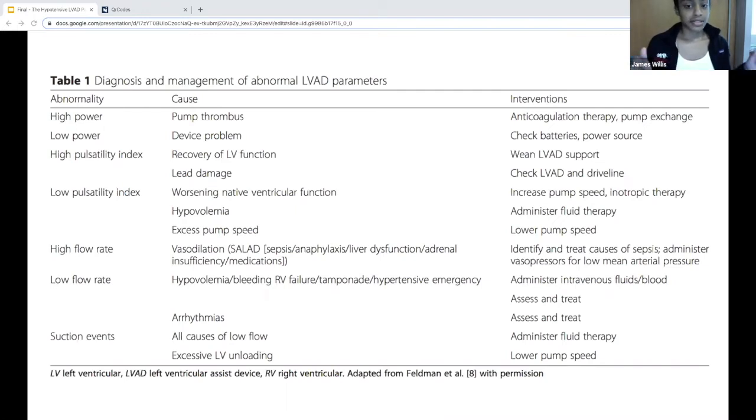Look at the circuit of connections. Something might be obviously damaged or unplugged. The patient's clinical picture and any other alarms on the device can help you assess what's going on. AP and lateral X-rays can show any connection or placement abnormalities that might require a surgical fix. If you need it, CT can show more precise dislocation problems.